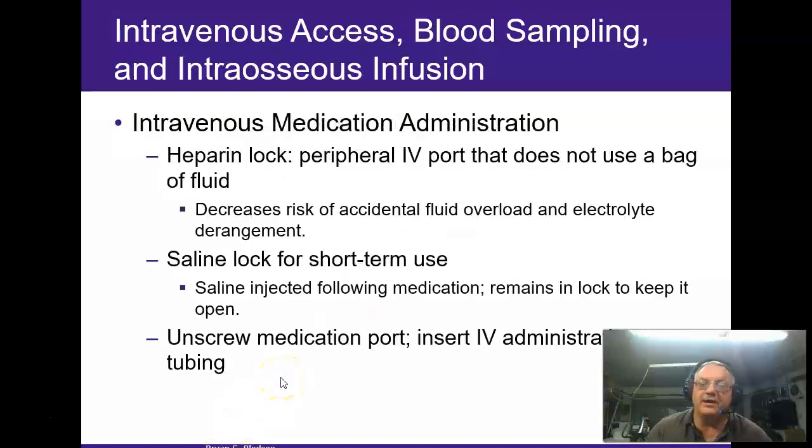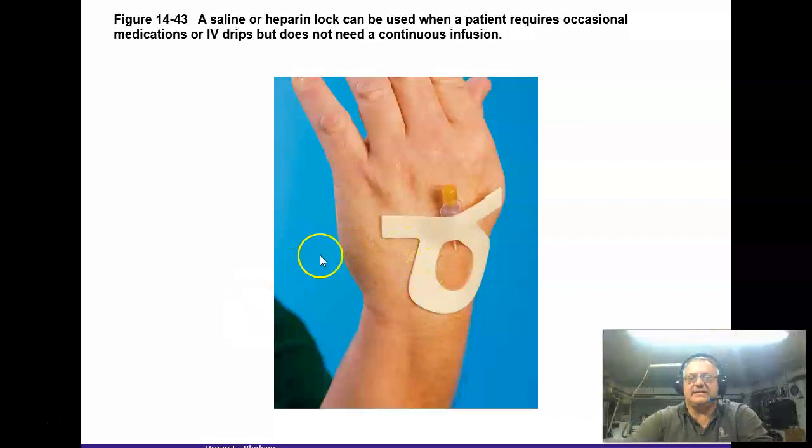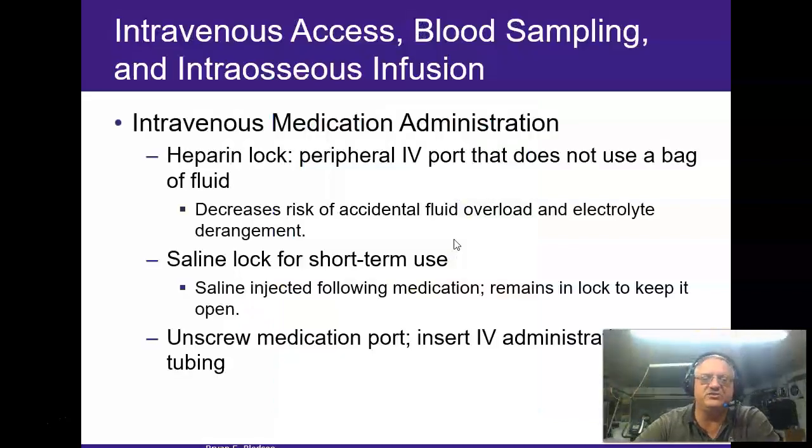A heparin lock or a medication access port, or a saline lock. These are, again, simple locks, or they may have an extension set on them. The reason they called them hep locks is because they used to push heparin into these. They found out if they just use saline, it's going to work just as well. It helps keep the vein open. The only reason is the heparin lock would technically not clot up.